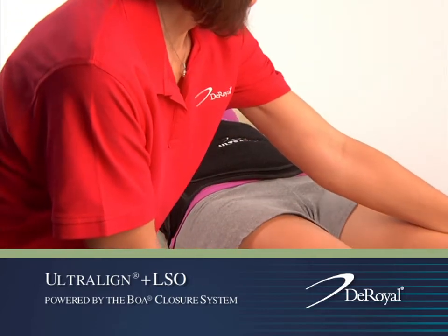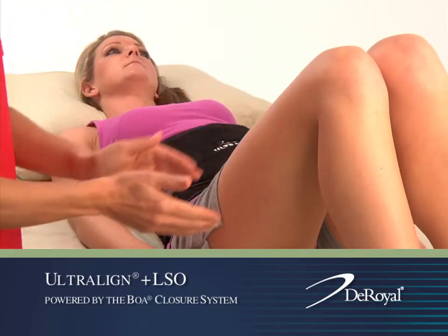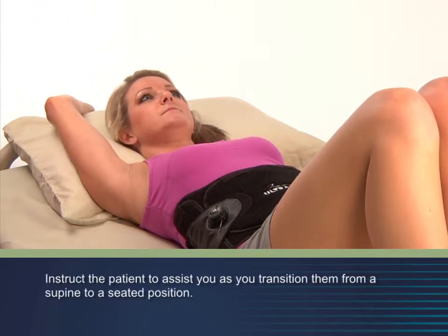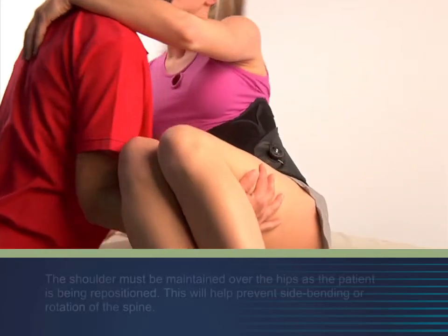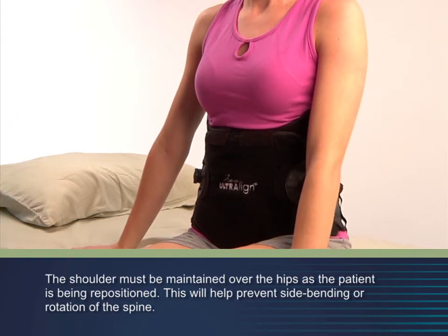Keeping the patient's legs together, gently bend their knees, monitoring the patient for pain. Position the patient's arm extended overhead with the elbow straight on the side on which they will be turned. Assist the patient to a seated position, keeping the shoulders squarely over the pelvis as the patient is being transferred.